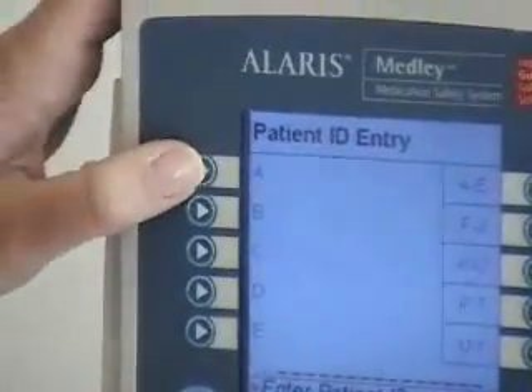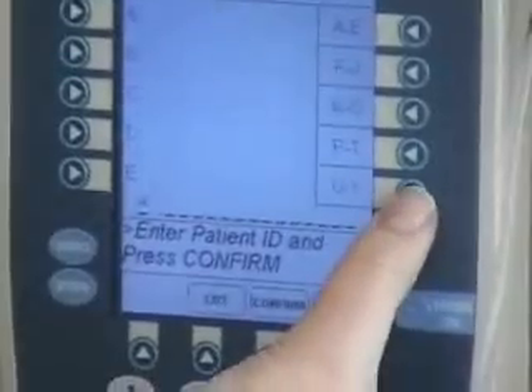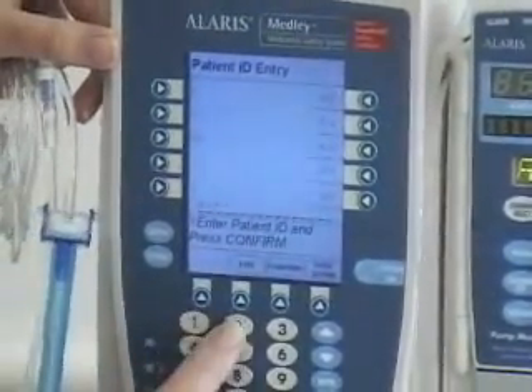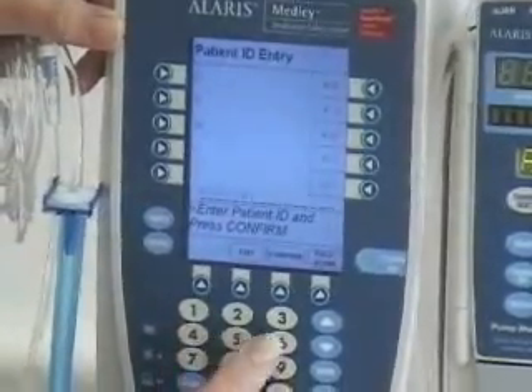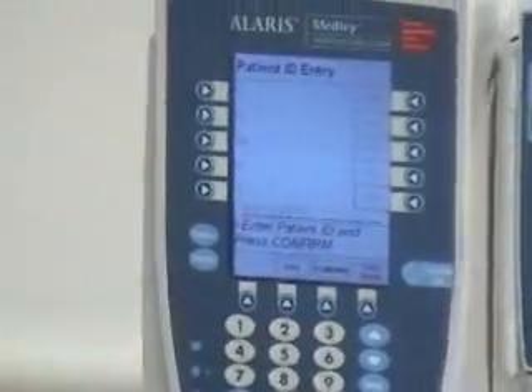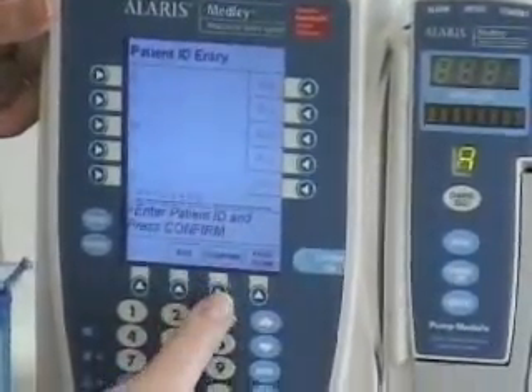We'll go with patient ID entry. I'm picking A, then B, then one, two, three, four, five, six. That's our patient's ID number — that's what you're going to find on the armband. And we'll confirm that.